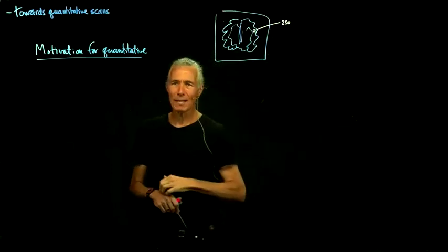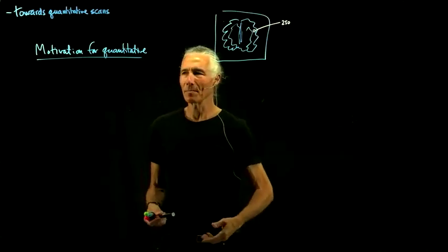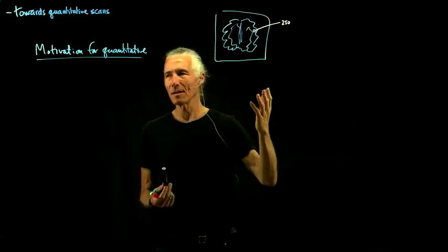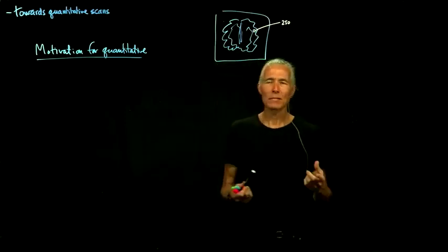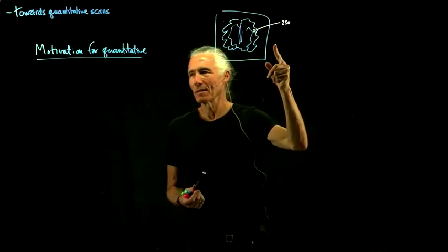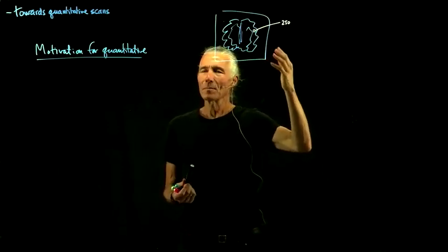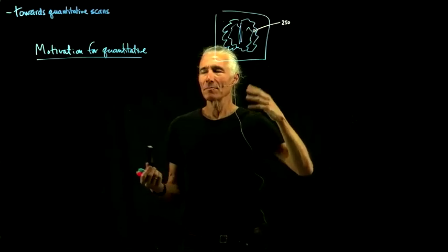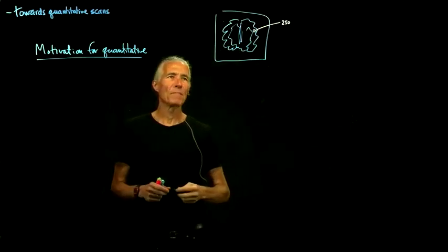And why is that? Well, maybe the person left their big belt buckle on, and it changed the shim. And if you go to another scanner, you might get, say, 11,000. So the raw numbers coming out of the scanners are somewhat arbitrary, depending on exactly how they've set up their imaging program.